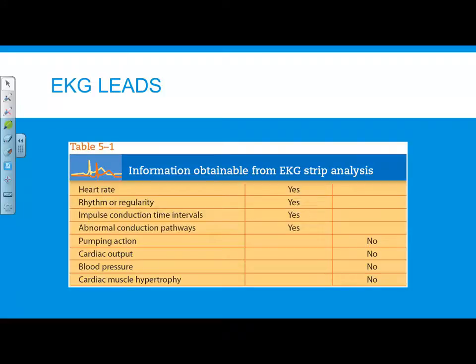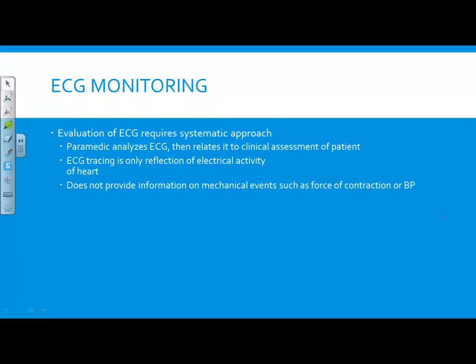How would we know that the heart is having a good pump? How would we know that the heart is pumping decently or good? All right, we're going to check pulse. We're going to check blood pressure. And we're going to look at overall perfusion status. Okay? I can't hit this enough: if you see something on the monitor, that's just a step in your treatment of your cardiac patient. Okay? All right.